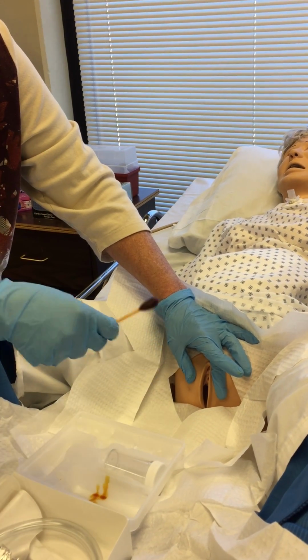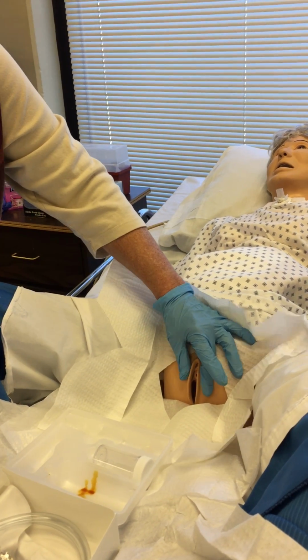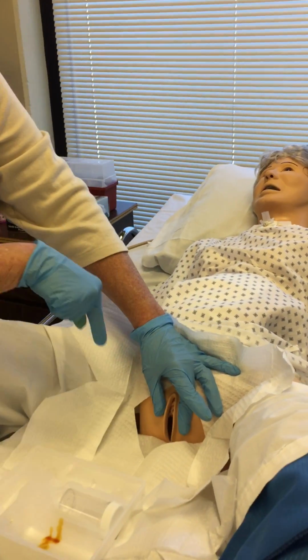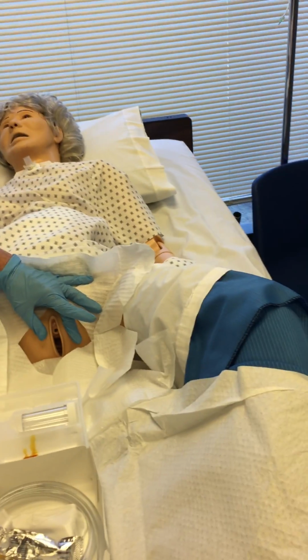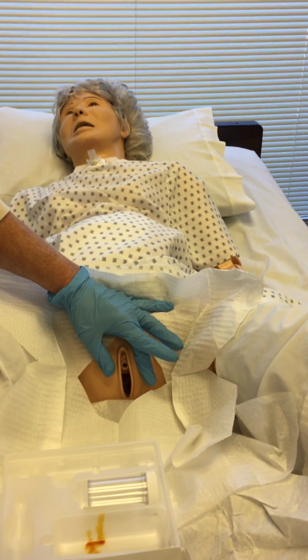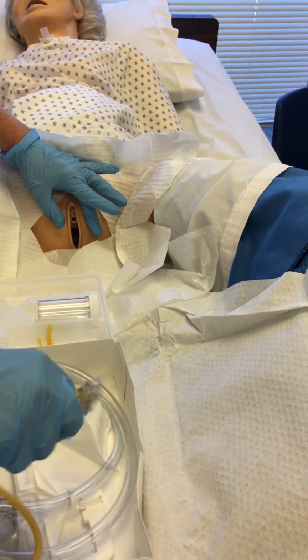And that's a good sign. I mean, it's not a good sign. It just tells you where the urethra is. Because like I said, it's not always that easy. It's not always this easy to find on a woman. All right, so we know where we're going. We're clean. 1 to 2 inches lubrication.